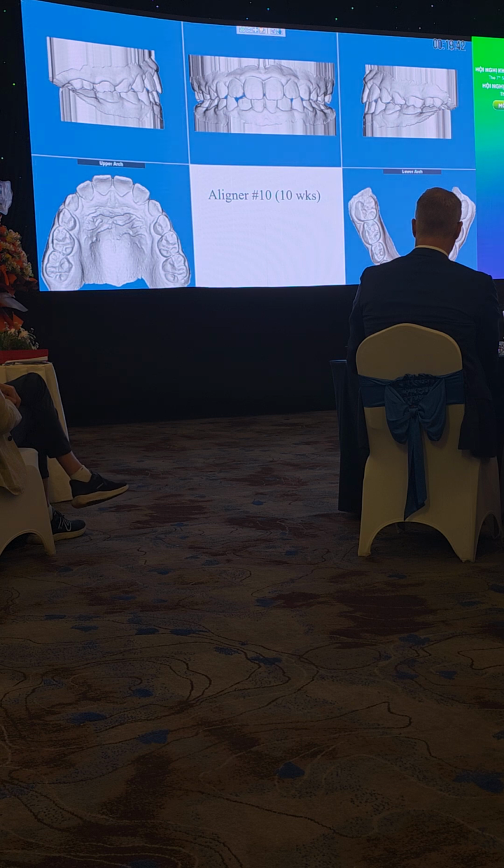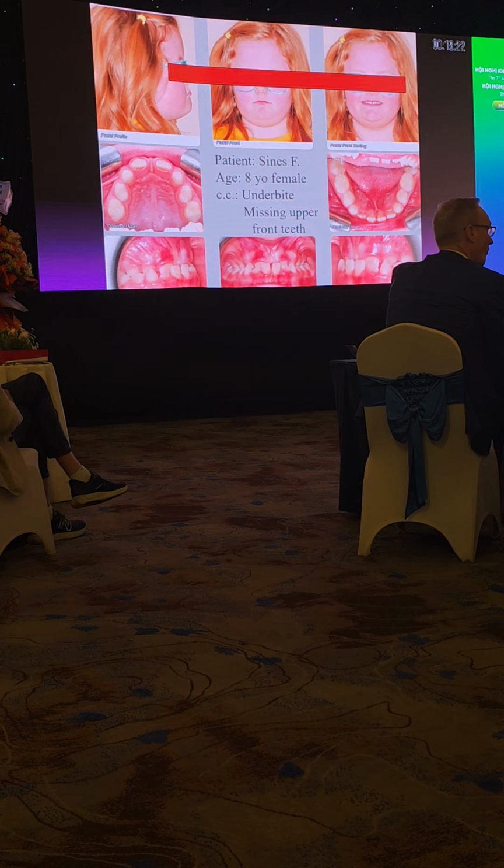How many? Well, you are too smart, you already asked a different question. Obviously, I only have the model, so it's a combination of skeletal and dental expansion, right? So how many millimeters? Give me a number. 6? Oh, see, these students are smart. 6 millimeters, that's not too bad, right?